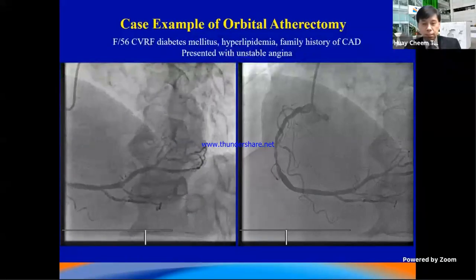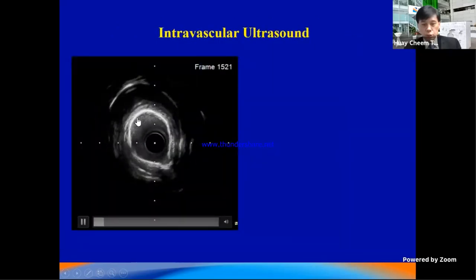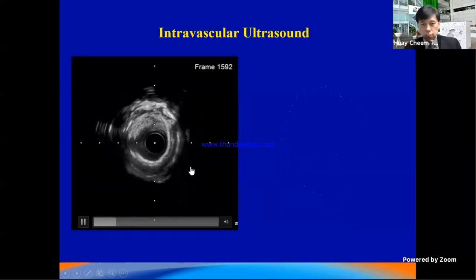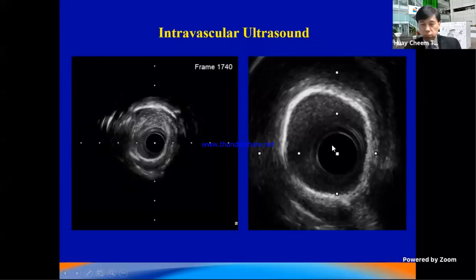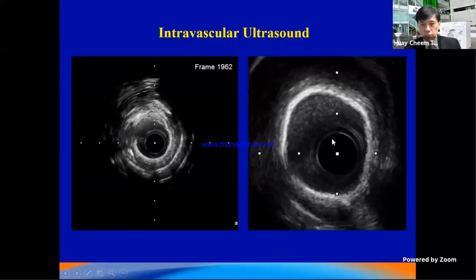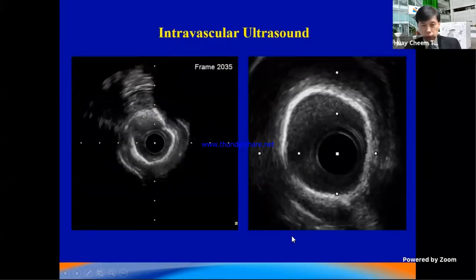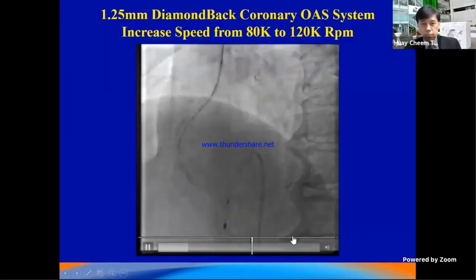And this is where I think orbital atherectomy is best. This is a patient with a very large vessel, as you can see on the still picture on the right side. This is a 4 millimeter vessel. If you were to do an intravascular ultrasound of this patient with this concentric calcium, and if I magnified it, this is a concentric calcium with an inner luminal diameter of maybe 2.5. There's no way any burr can achieve any sort of ablation in this sort of lesion. And this is a situation where I feel orbital atherectomy is at its best.